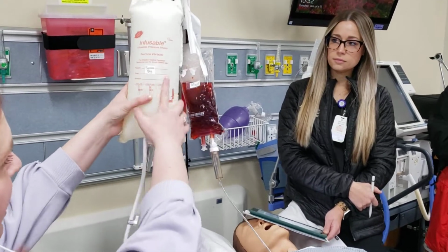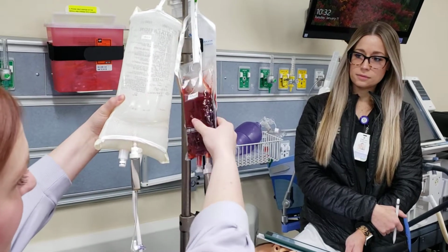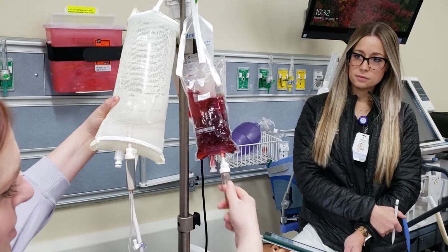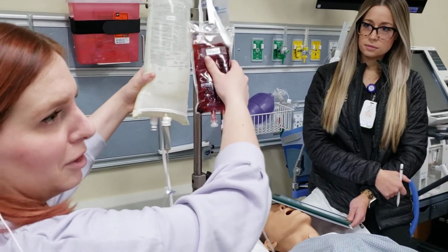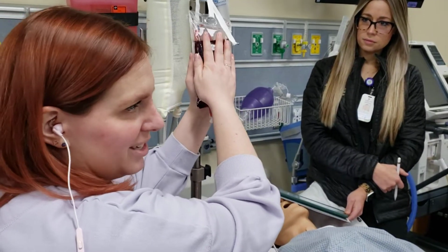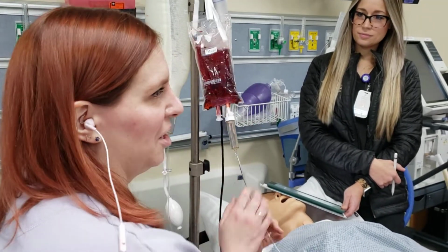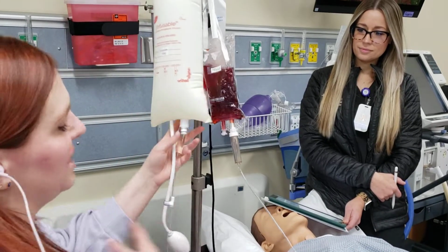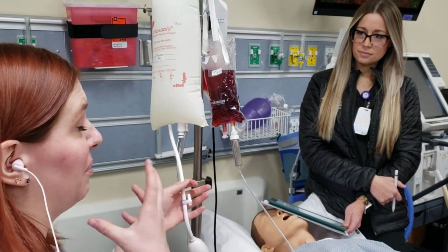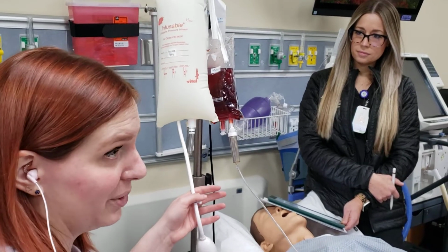We have a pressure bag here, which holds back the pressure from the patient. So this is our patient, which normally, as we are aware, would be pressurized from the heart, but since we don't have a beating heart patient, well, that's why we have to have a pressure bag to hold back that pressure from the heart to prevent blood from coming back into our line.